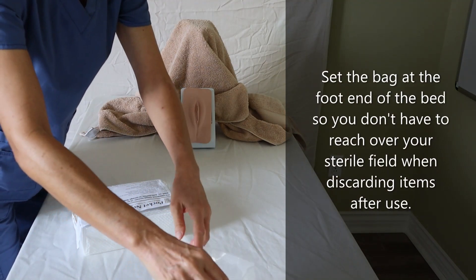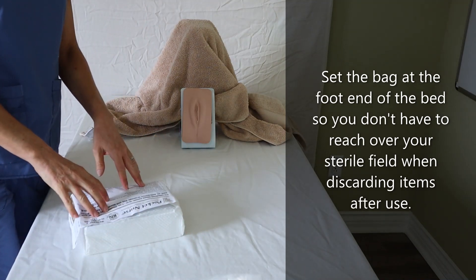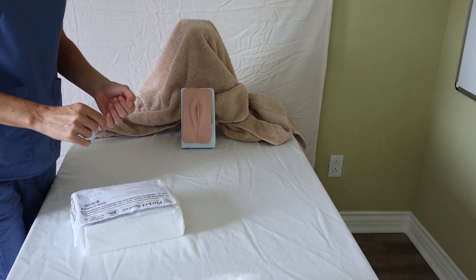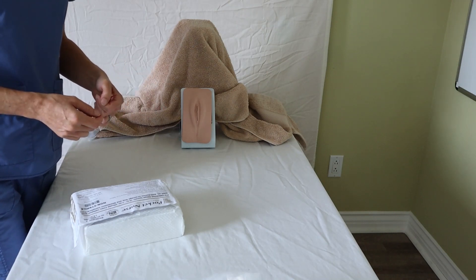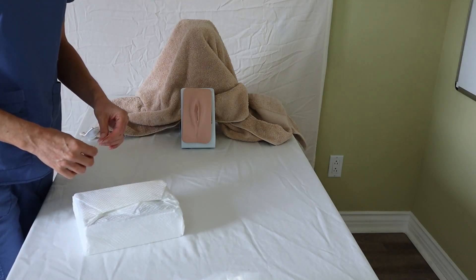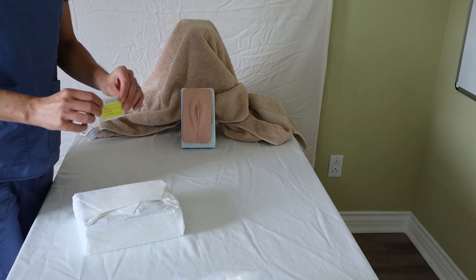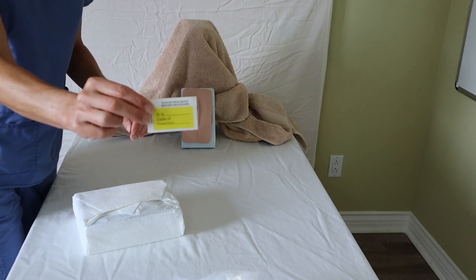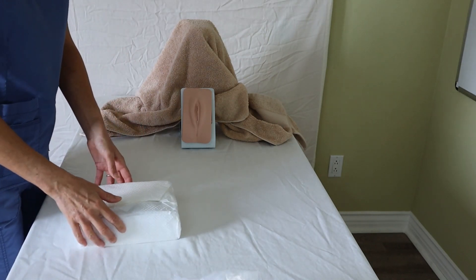Keep in mind there might be special circumstances where your patient might not be able to open her legs because of a hip surgery or any other restrictions from the musculoskeletal system, so always make sure you are aware of those limitations ahead of time. The kit also comes with a sticker that tells you the name, the date, and the insertion information of who did it.